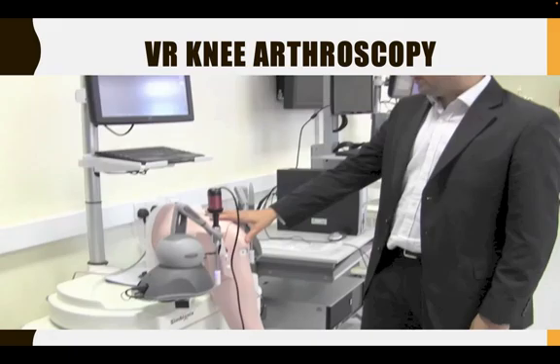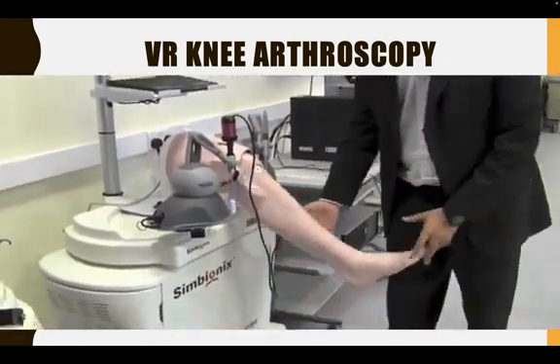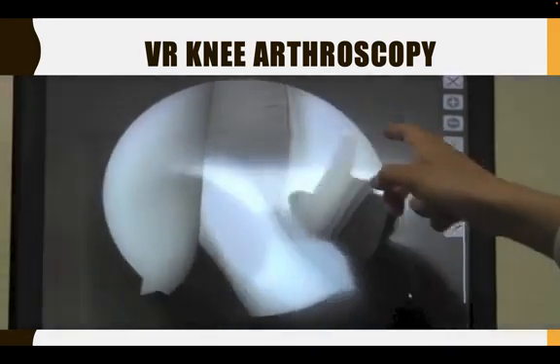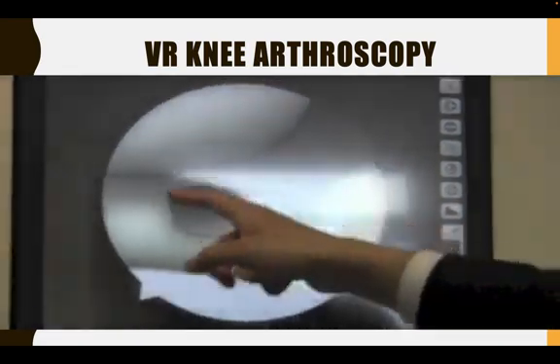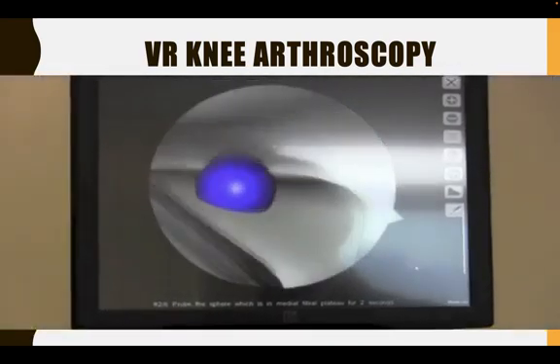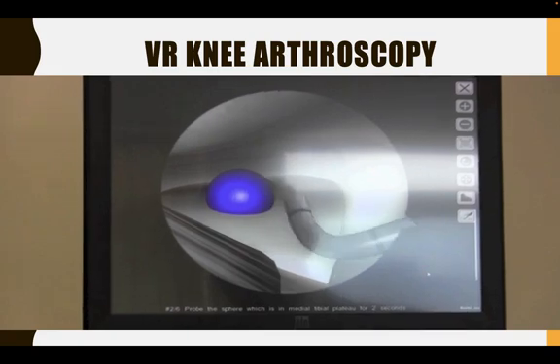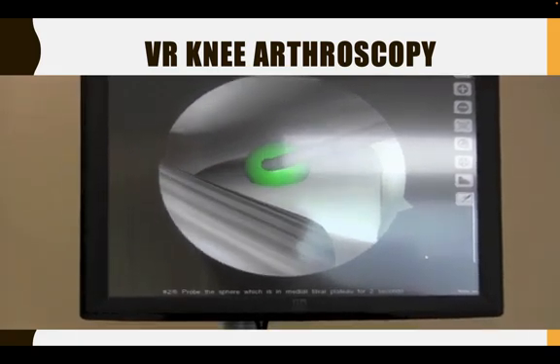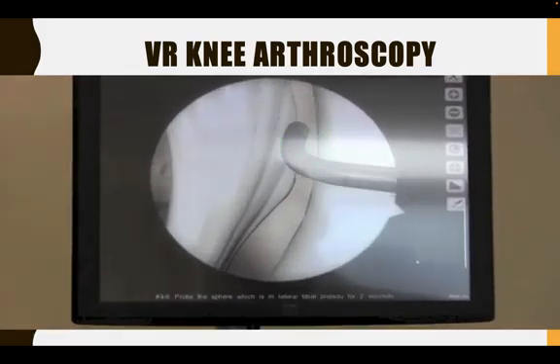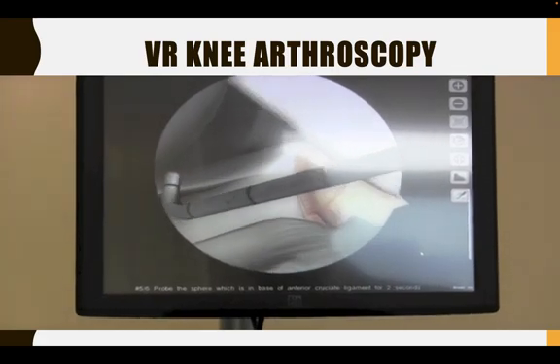We also have arthroscopy, where we've done many shows for healthcare professionals, physiotherapists, and the public on how we want to train the future generation of orthopedic surgeons using virtual reality, so that the trainees are confident in what they are looking for and what they are doing long before they enter the operating theatre. This is a probing exam, a 10-point exercise where the participant will familiarize themselves with the localized and regional anatomy, but also be able to practice their hand-eye coordination and spatial awareness, as well as triangulation, in order to find the important points that we all look for during the knee arthroscopy.